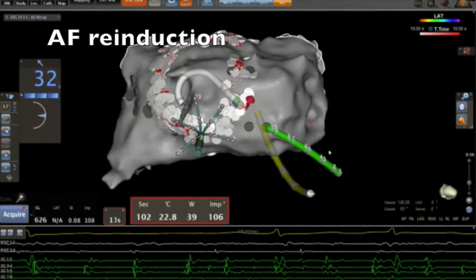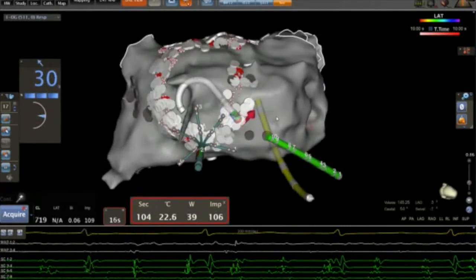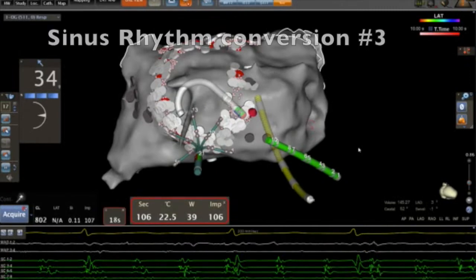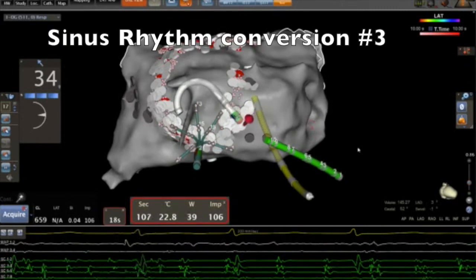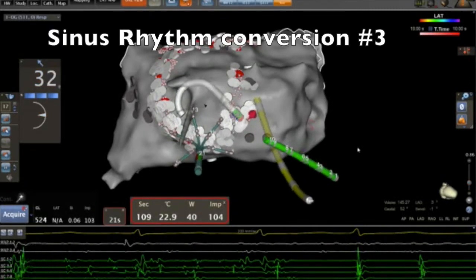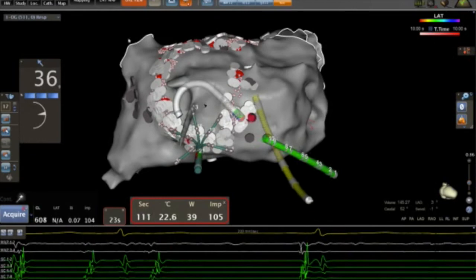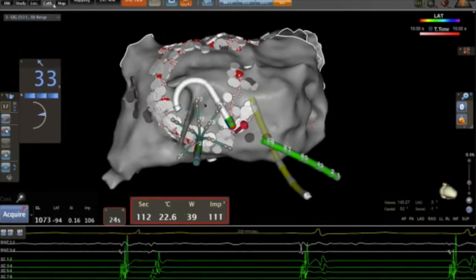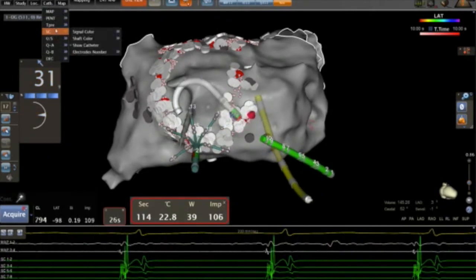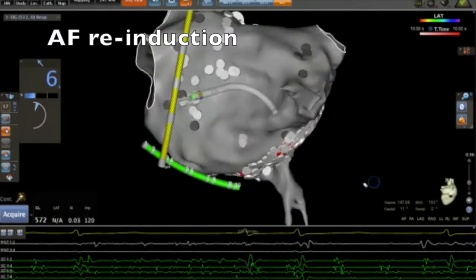We re-induced AFib and, as you can see here again, we terminate AFib another time. We use 40 to 45 watts and 30 grams here because the tissue is very thick.